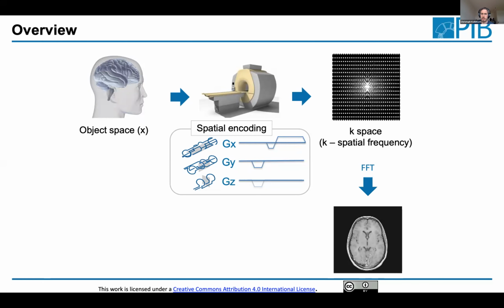So basically what we have to do is get the data from our scanner. Based on a lot of information in the data, we can set up our acquisition model. And then most of the things are taken care of by Gadgetron or the SIRF wrappers around it, such that we can do a very simple reconstruction. For the remainder of the course, we will stick to Cartesian sampling. Gadgetron specifically, but also SIRF now, has the capabilities to do non-Cartesian sampling, but that would be too far for this training school. So we'll stick with Cartesian sampling for all the example notebooks we are providing here.